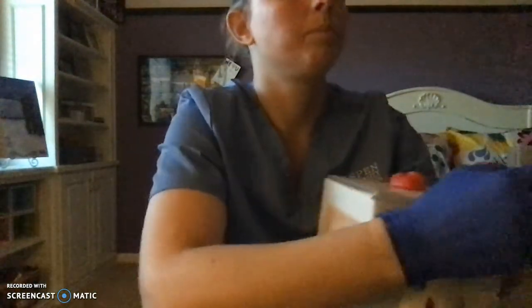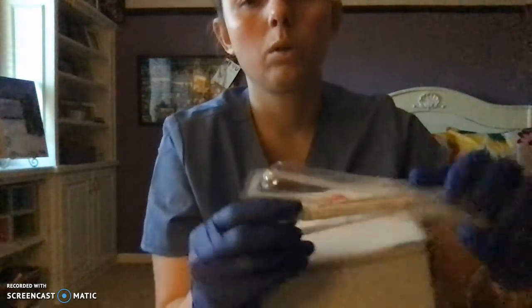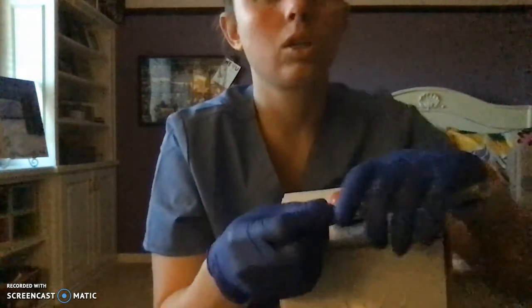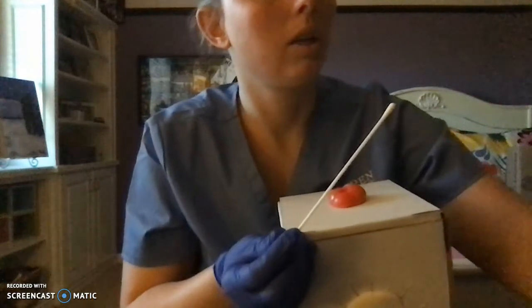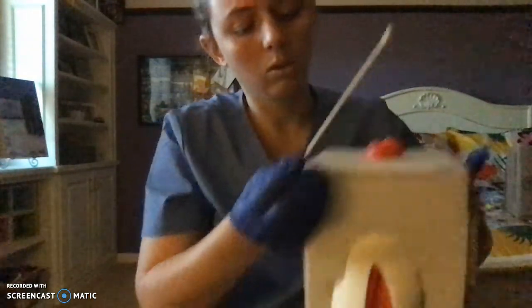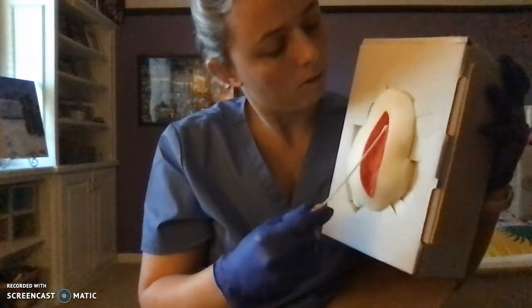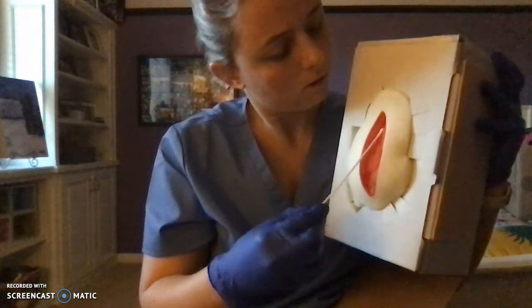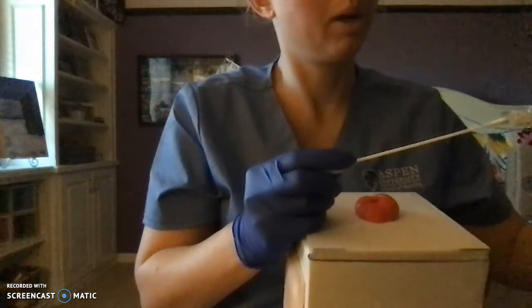I brought in the specimen swab. So you would take it out of the package. You make sure that there's a seal on it. You're gonna not let anything contaminate that. And then you are going to find an area that has drainage and you're gonna go in there. Okay. And then you put it back in.